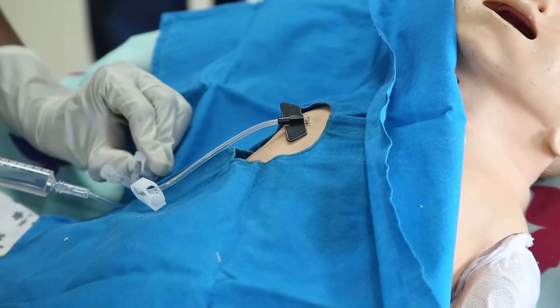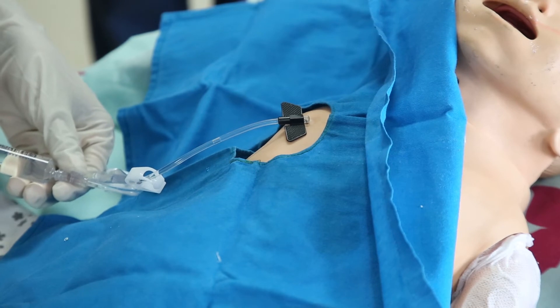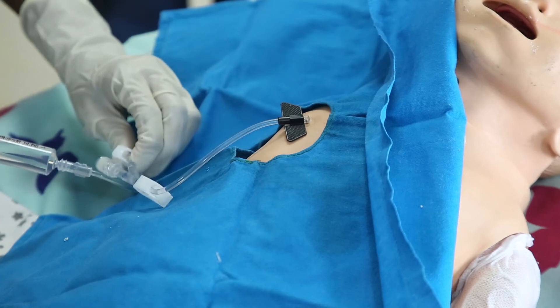If there is any gap present between the needle and the skin, the space can be covered by a sterile gauze piece and cover the needle with an occlusive dressing like tegaderm and tape.